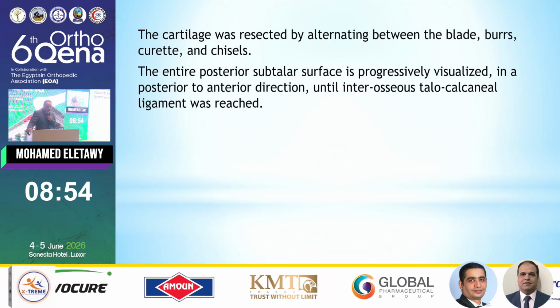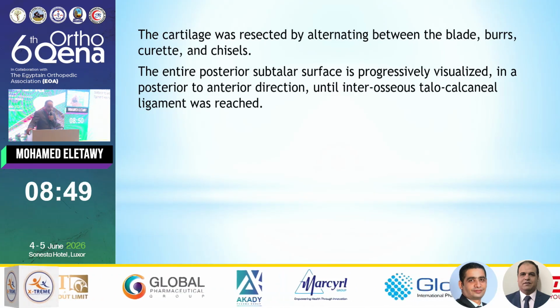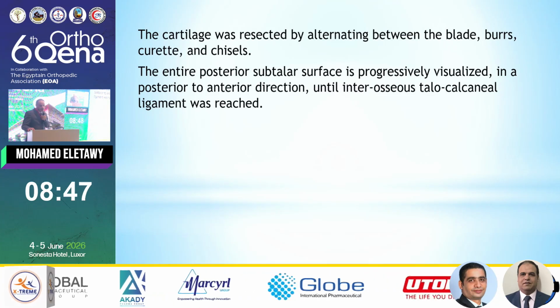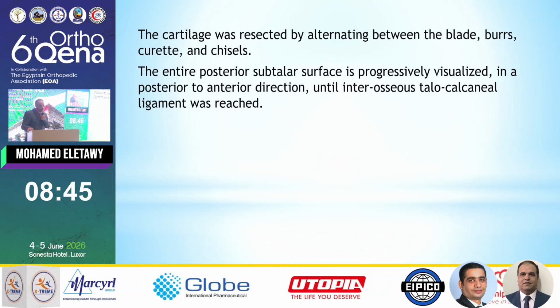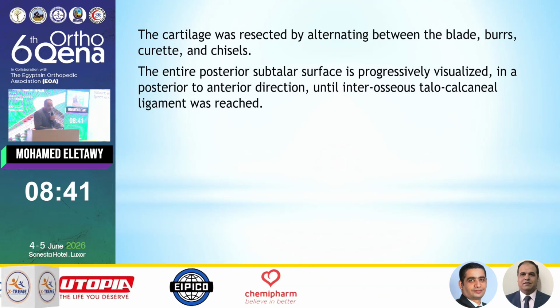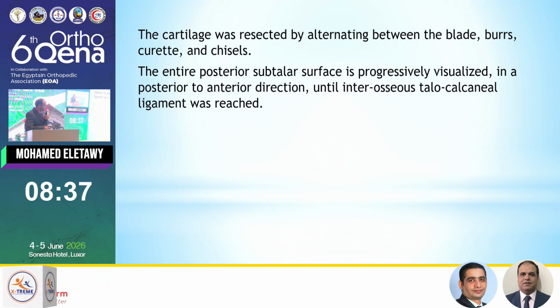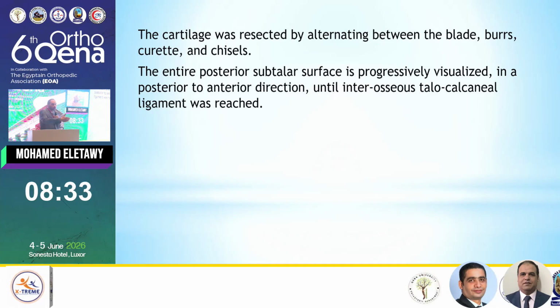The cartilage is resected by alternating between blades, burr, curette, and chisel, and the entire posterior subtalar surface is progressively visualized in a posterior to anterior direction. Till what? Till the interosseous talocalcaneal ligament. The interosseous talocalcaneal ligament is the anterior boundary for this maneuver.